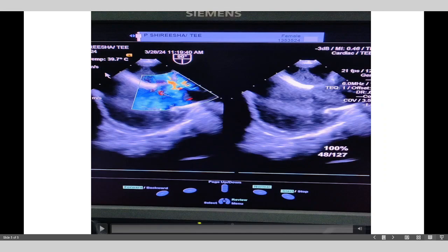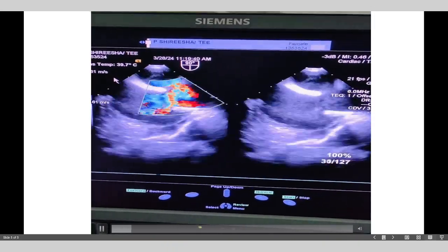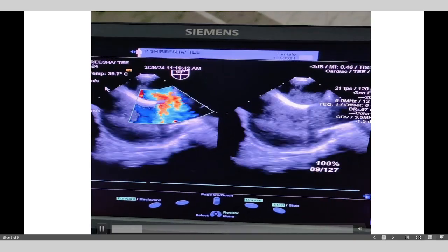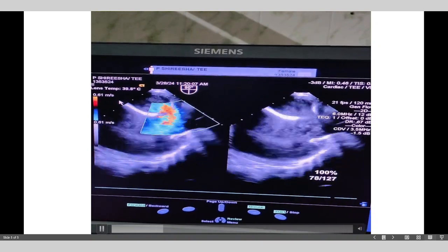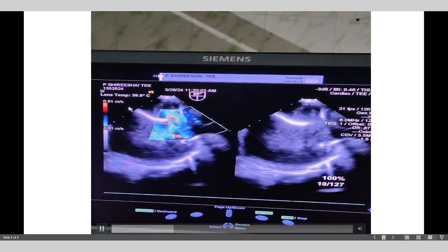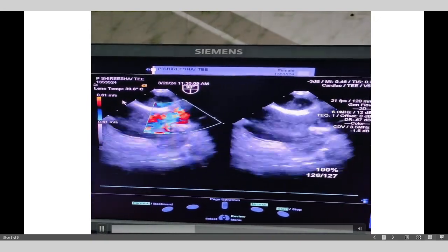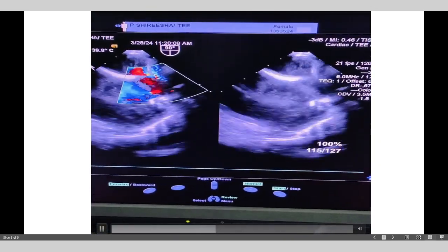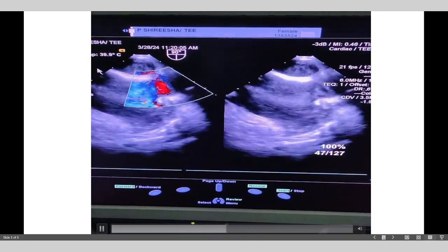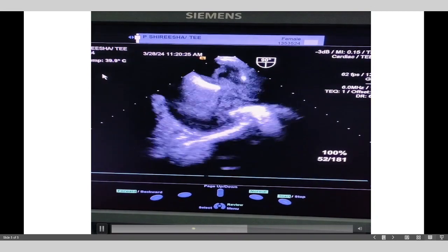And this is the transesophageal echo picture of the bicaval view. As I mentioned, the bicaval view is taken at 90 degrees, showing this is the SVC and this is the IVC, the superior part is the left atrium and here is the right atrium. Here you can clearly see in color Doppler the blood is going from left atrium to right atrium across the SVC type of ASD, and there is turbulence because the right upper pulmonary vein is anomalously draining, causing the turbulence there.